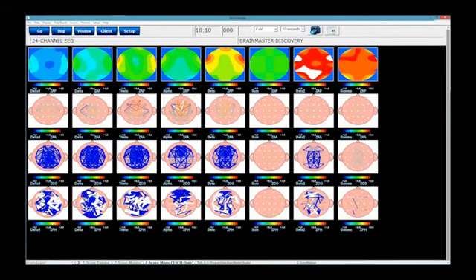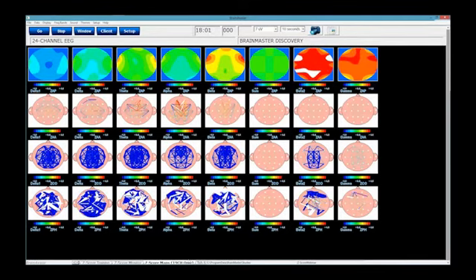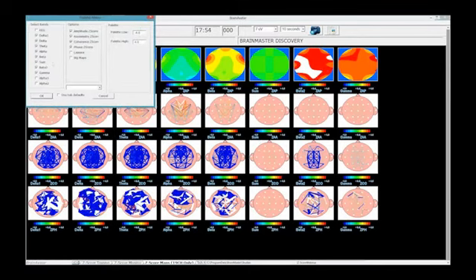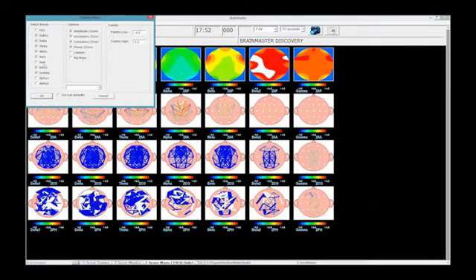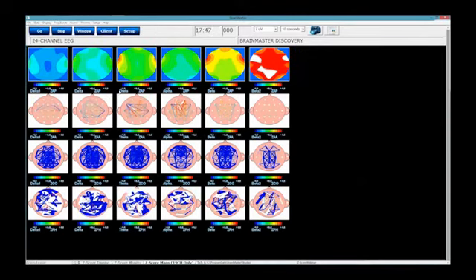Now, here's another screen that we have on all of our ZOK protocols, but it's probably the most useful in 19-channel mode. These are live maps that display the information as training is occurring. You've got your different maps being produced, and I usually don't like having that one on, or my gamma one. I usually just turn those off, since they give me the least amount of data.